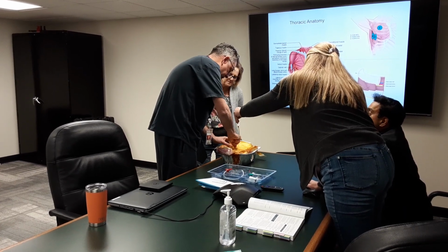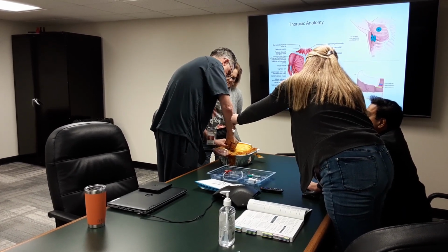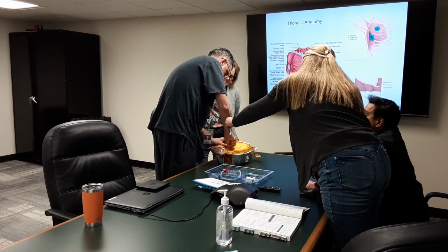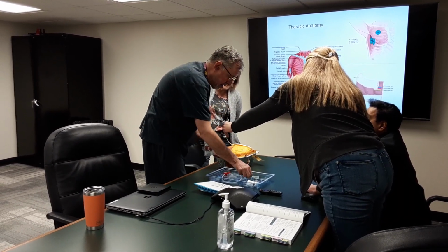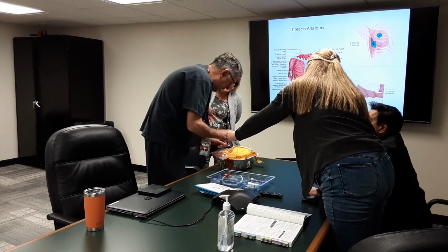Alright, and this is the part. This is actually fairly realistic. Yeah, it does have one. There you go. Didn't make the incision big enough. Very common mistake.